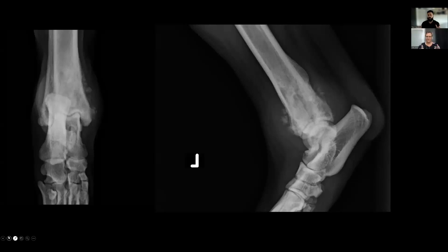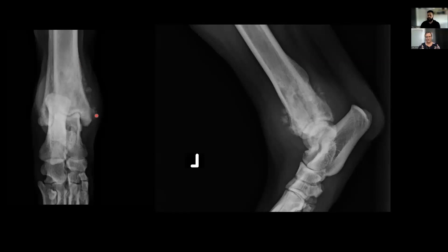The clinicians did a wonderful job focusing on the area where they found pain on their orthopedic exam. This patient had swelling and pain at the level of the distal tibia of the left pelvic limb. The radiographs acquired are nicely collimated — a craniocaudal projection on the left and a straight lateral projection on the right. The first thing that jumps out is new bone proliferation along the medial aspect of the distal tibia, with bone proliferation at both the caudal and cranial aspects.